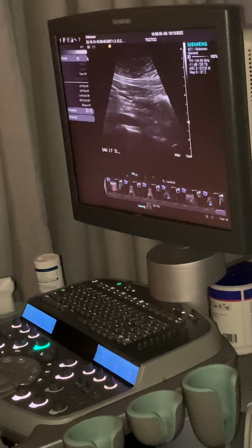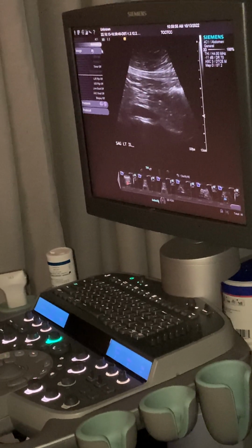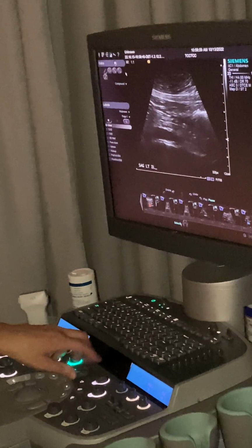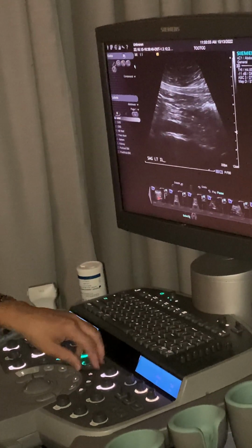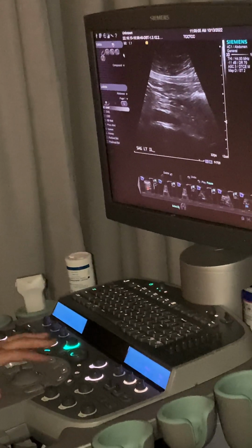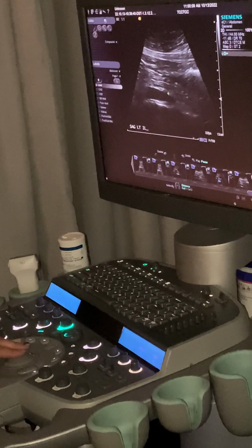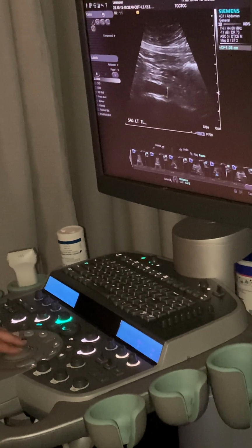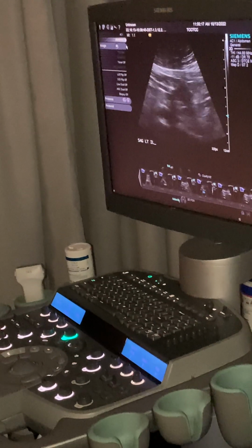See if we can come back. So I went over to our left side just to angle back a little bit, to see if we could lengthen it out. And there's the left of the length. So we have our distal left iliac. We can get a little cleaner. So we're going to caliper him, outer to outer. We have a little bit of an angle because he starts to dip down. And then we're going to get some color on him.